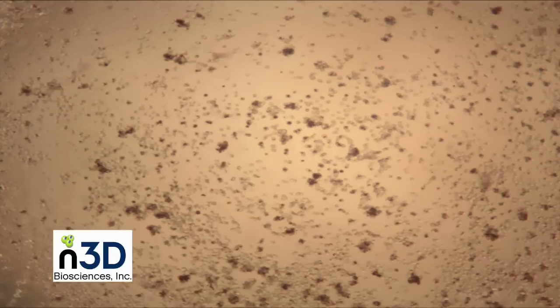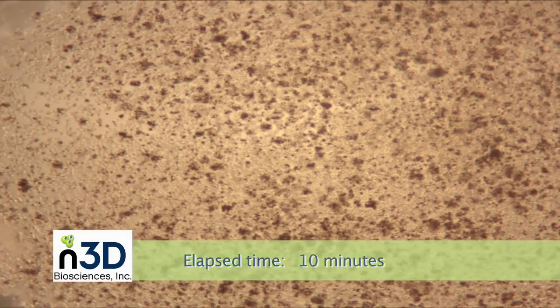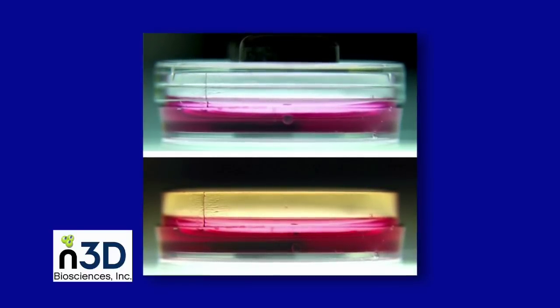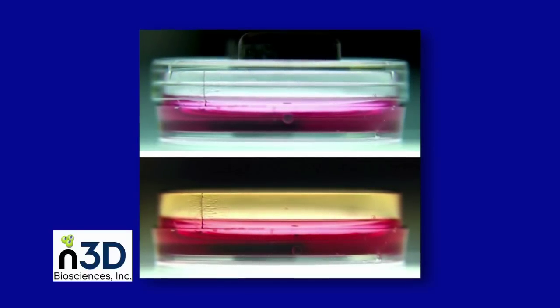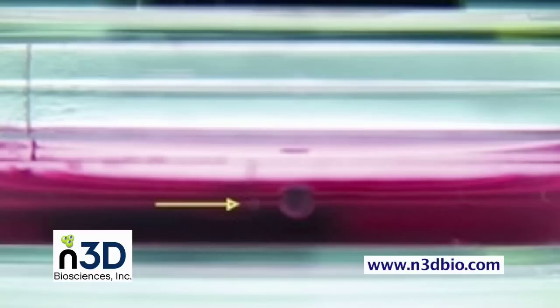You can now place the BioAssembler into the incubator. Here are time-lapse images of a culture of lung adenocarcinoma cells, starting moments after placement of the magnet. In any format of the BioAssembler, within a very short time, cells will be levitated to the air-liquid interface and concentrated under the magnets, and 3D cellular structures will begin to form. Cell-cell interactions will typically determine the tissue microstructure within a few hours of levitation.